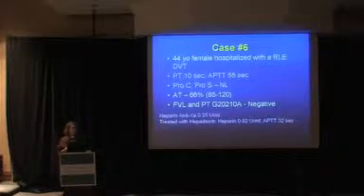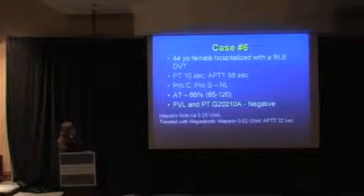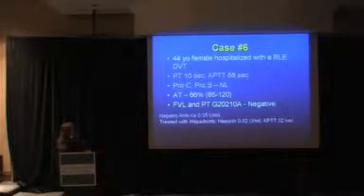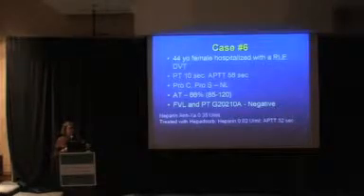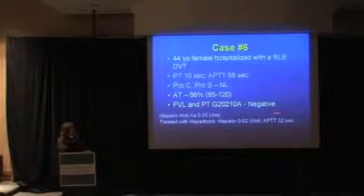We don't stop there. We actually neutralize the heparin activity. We treat them with Hepadsorb. There's Hepzyme. There's a lot of other ways to get rid of heparin or neutralize it. And after we treat it with Hepadsorb, we always remeasure the heparin assay, make sure that we've gotten rid of the heparin, and then look to see what happens to the PTT.